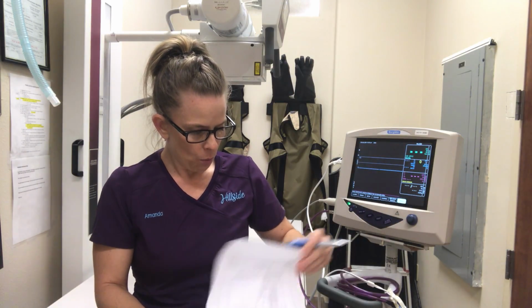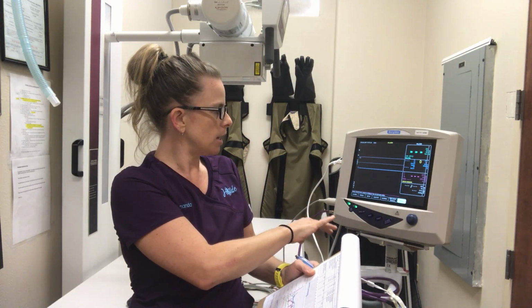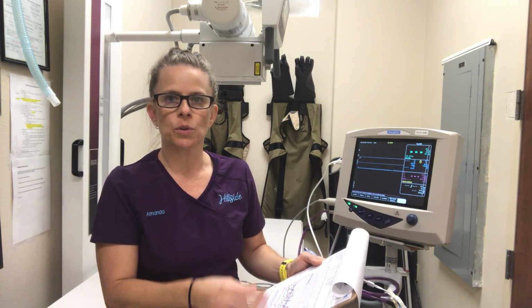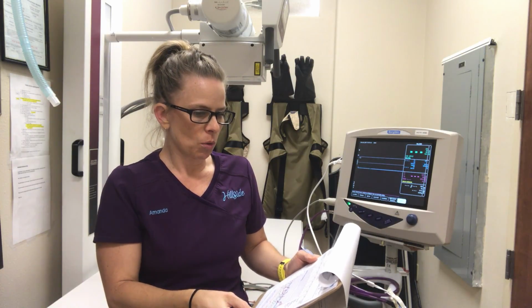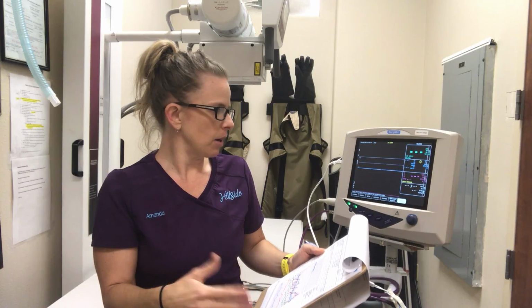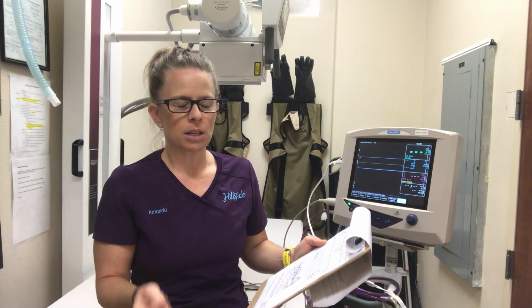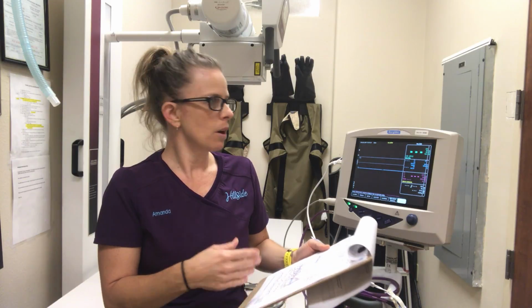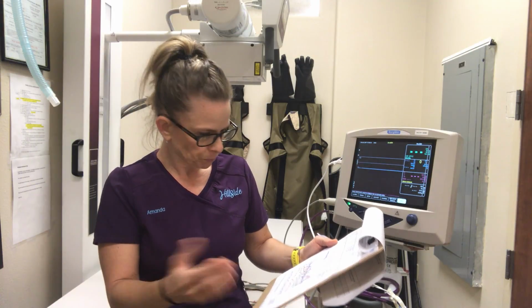And then we are always monitoring their temperature. You can do it with this machine. I have found that it doesn't seem to be as accurate as just using a thermometer and checking it every 5 minutes, so always wanting to do that. We do record that as well, so that we're making sure that they're not getting too cold. We definitely don't want any hypothermia or hyperthermia, we want to keep them at a nice normal. A normal temperature for surgery, 97 to 100 degrees Fahrenheit, is good. We also here use a rewarming unit, so it helps the little guy stay a little bit warmer.